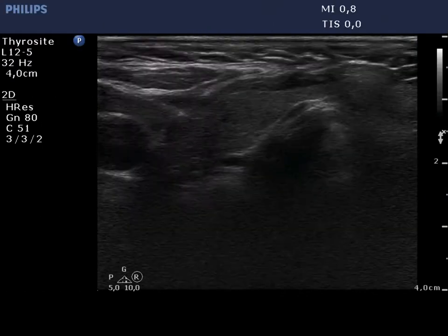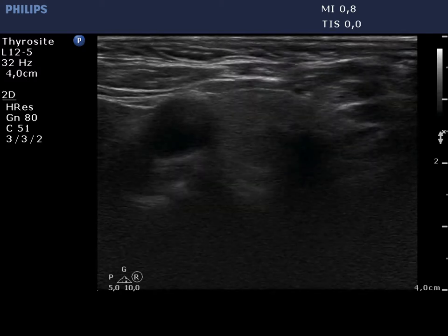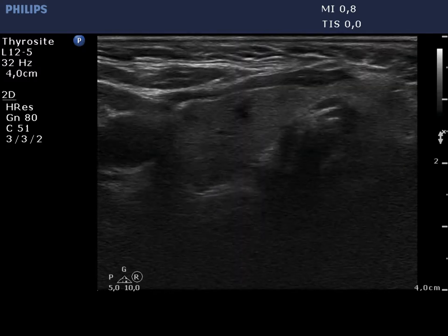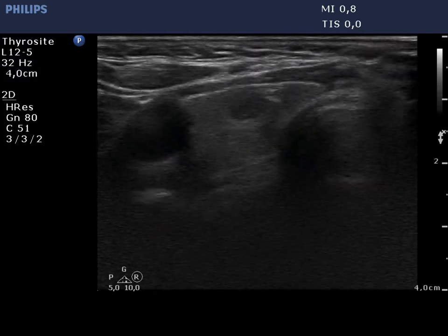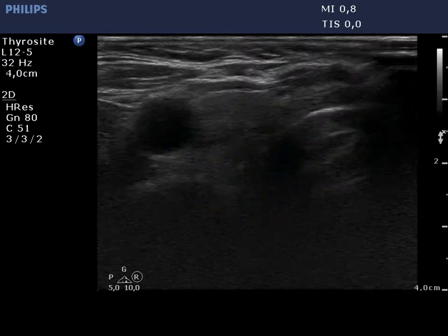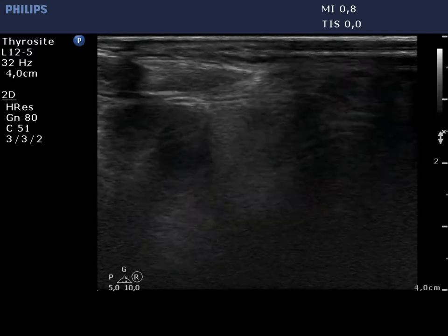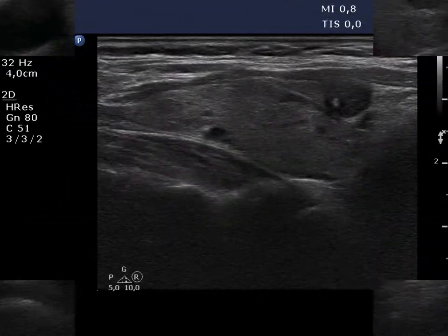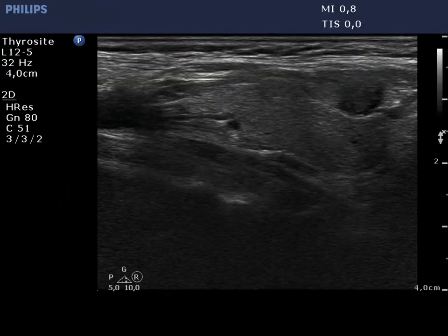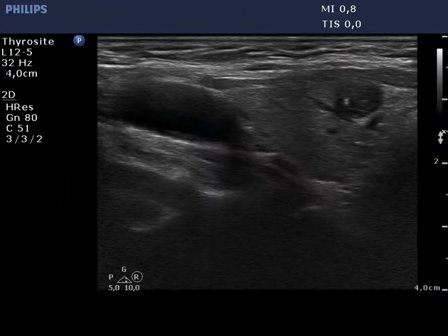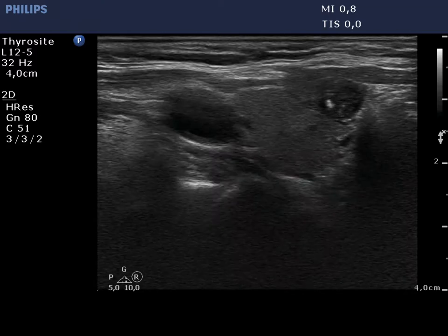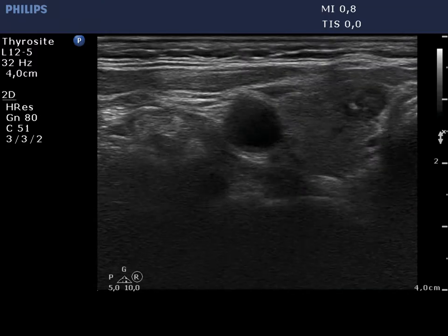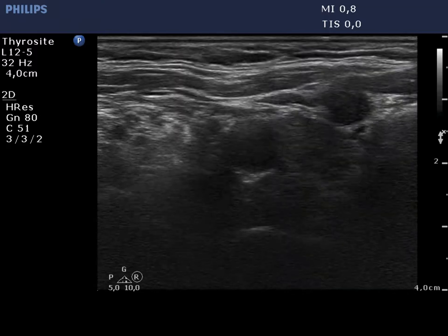The horizontal view of the right thyroid is presented. There are multiple small lesions with different echo patterns in the lobe. The ventral hypoechogenic one may have oncological significance. This nodule contains hyperechogenic granules.